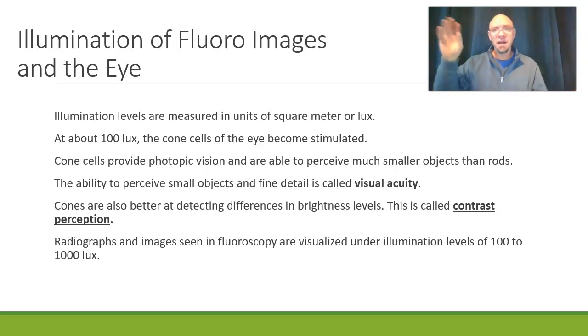I'm used to having kind of a dimly lit room. But you want to have it at the appropriate level so that not only are your cone cells stimulated to see the detail, but also maybe the rods are involved as well, and that can also help perceive some of the detail on the screen. So all of this is important, and all of this you need to remember for your test.